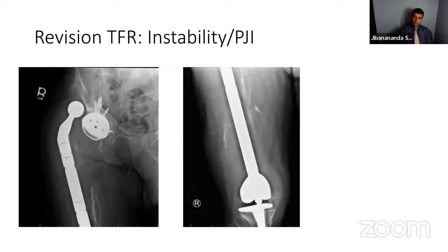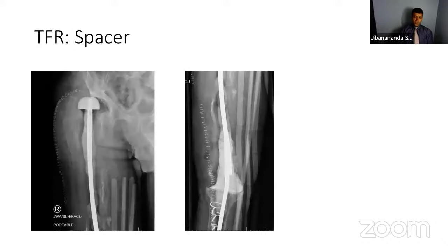This was another patient referred to me. He had a total femur done in Pennsylvania, and then he presented to us with a dislocated hip, and also had infection. He was growing Corynebacterium jeikeium. It's a bad bug. So we explanted that. I used my customized spacer.